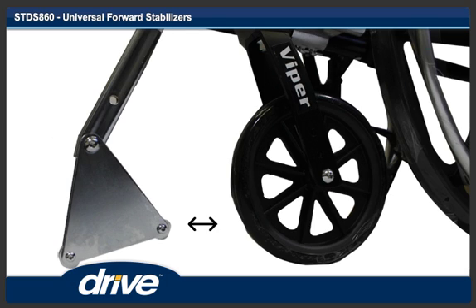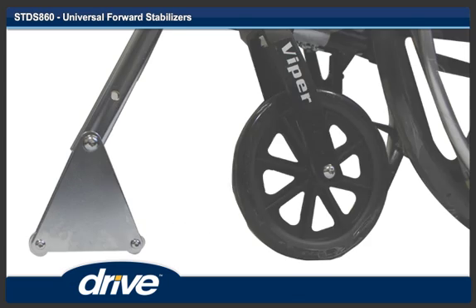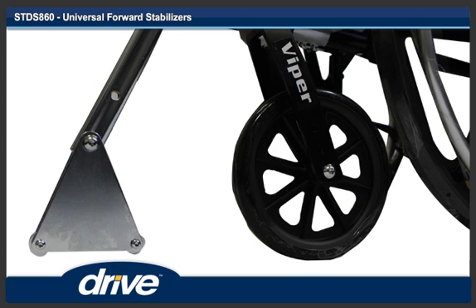Step 8. Verify that the front caster will not hit the front anti-tipper when the fork is turning. If the caster does hit the front anti-tipper, slide the front anti-tipper forward. When all clearances are verified, make sure that the front anti-tipper is perpendicular with the ground and tighten both carriage bolts.